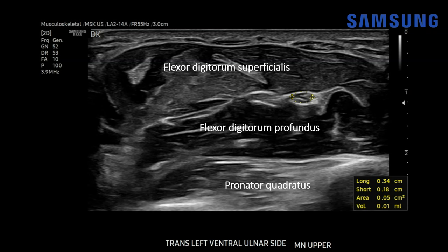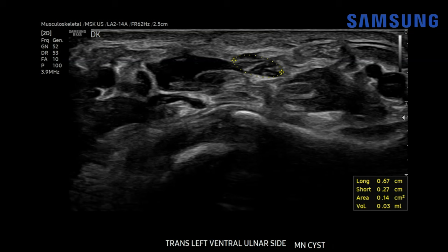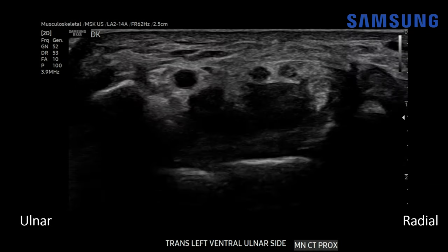As we go more distally towards that cystic mass, we can see that the nerve expands quite significantly — now it has an area of about 14 millimeters squared, so that's abnormal. Generally, a median nerve area increase of two millimeters squared or more is considered significant compression. Now we've moved distally to the wrist crease, which is the level of the carpal tunnel.